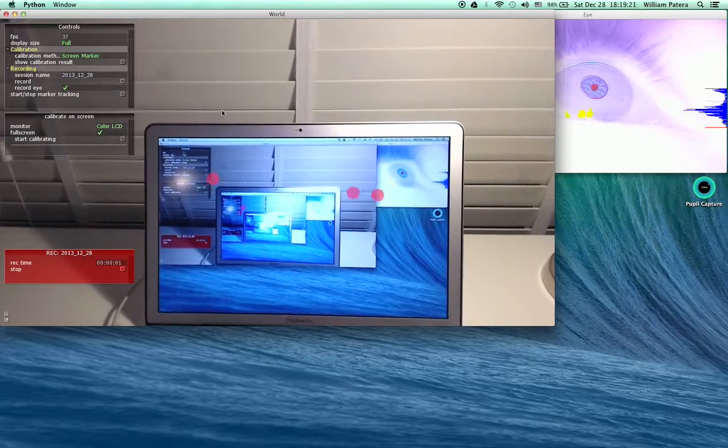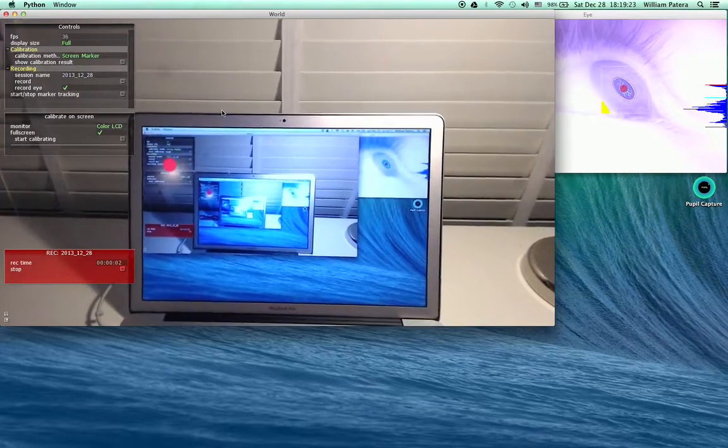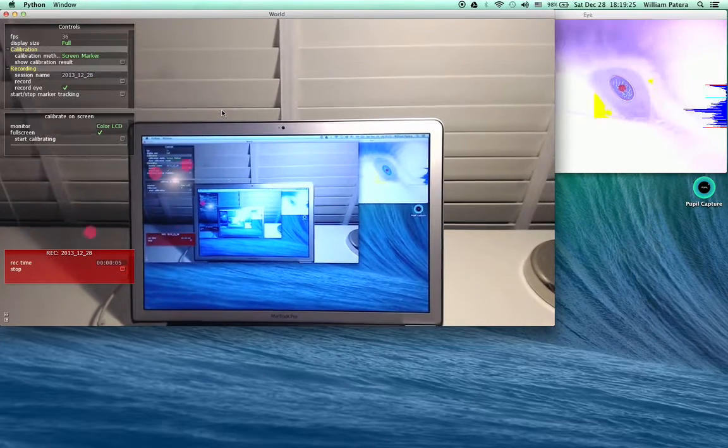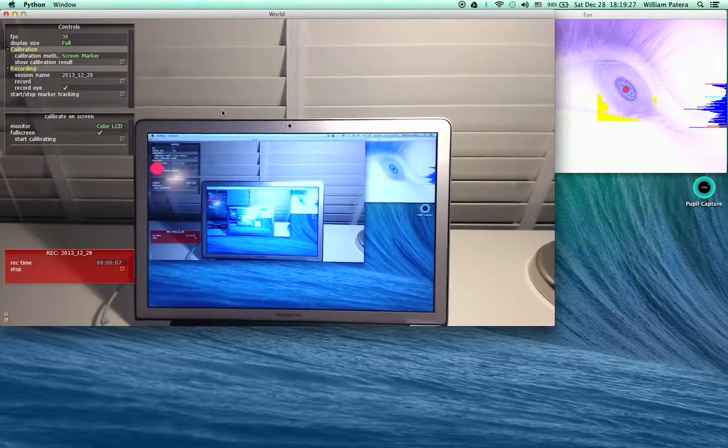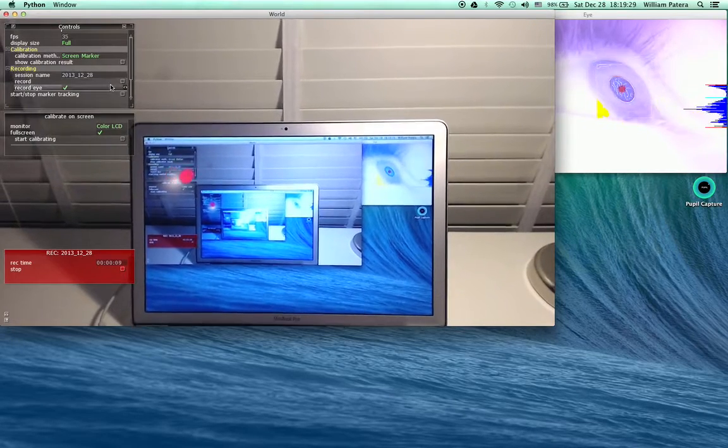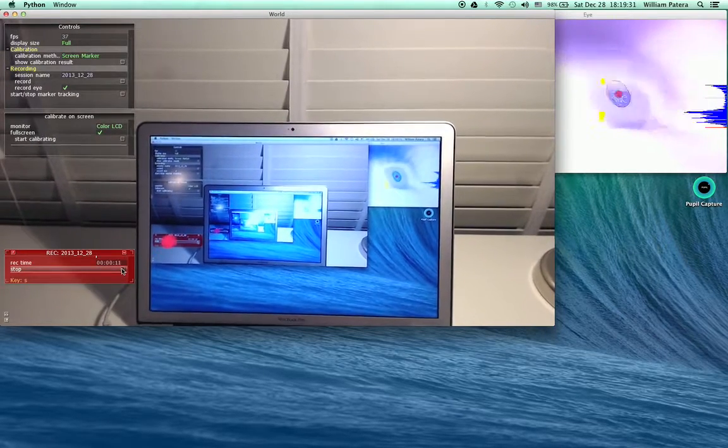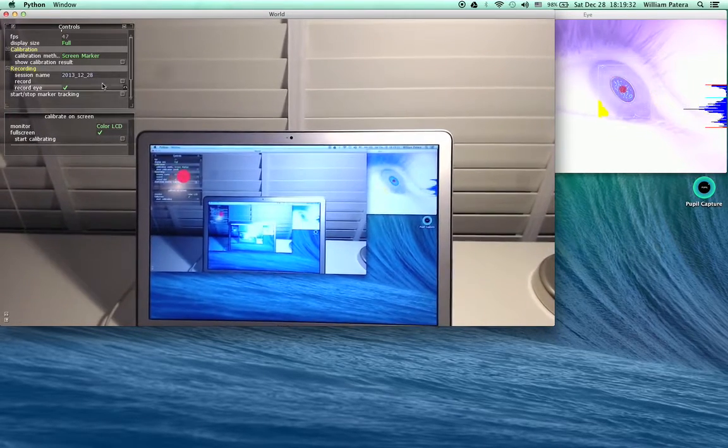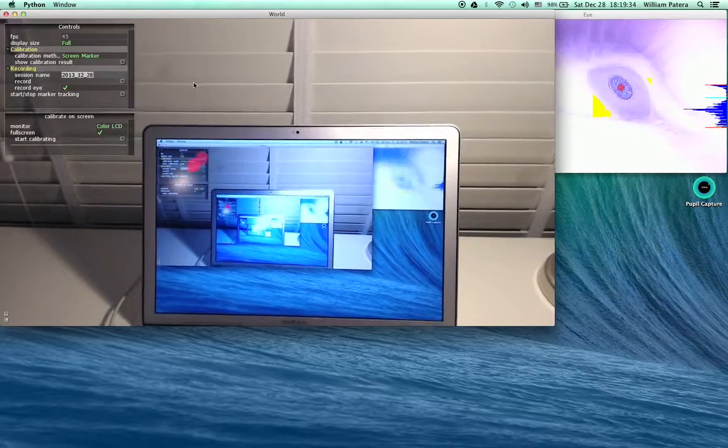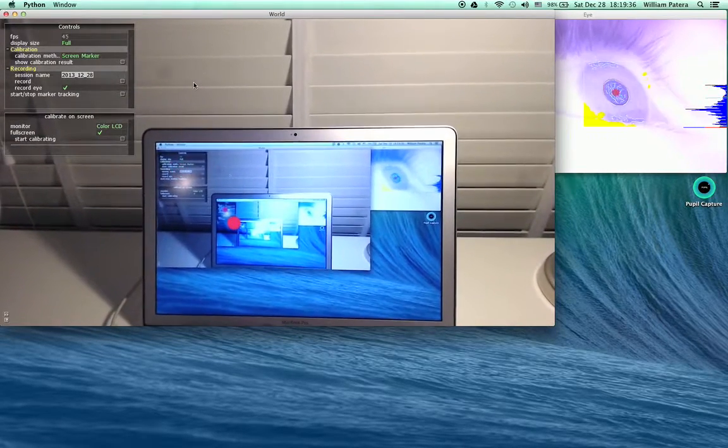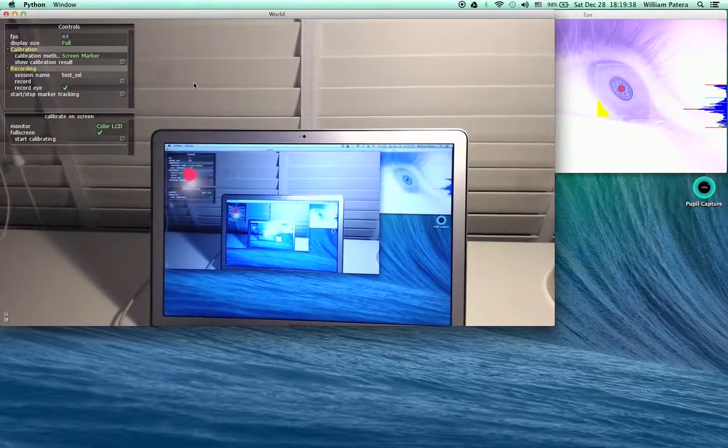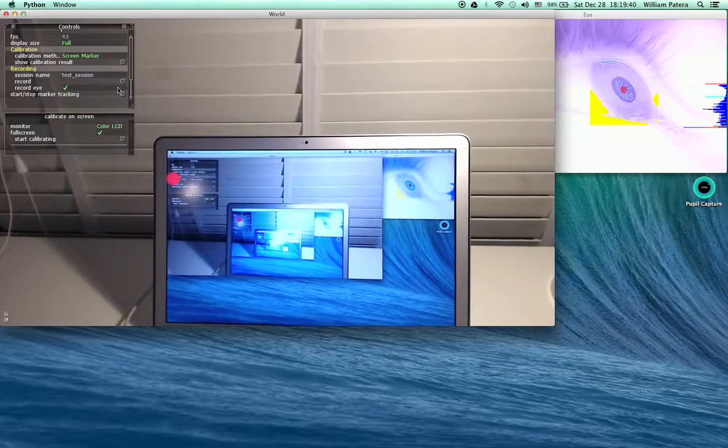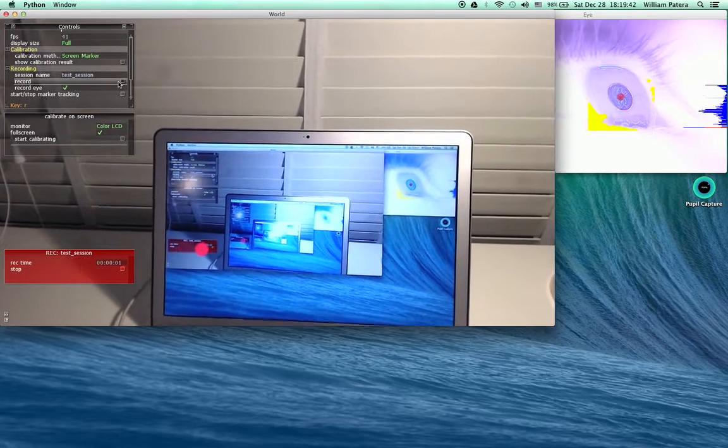If I stop and start another recording, that's absolutely fine. We won't overwrite anything; we'll just make another folder within that same session. We can also make our own session names and make a recording there as well.